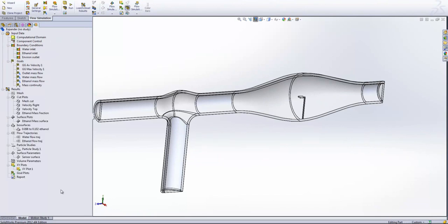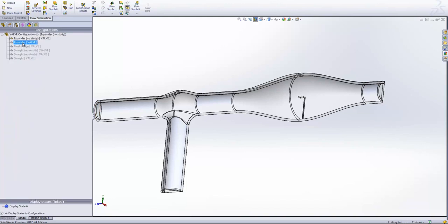The really nice thing that you'll see is we've also got all of our results analysis tools set up exactly as they were before as well. So we can now start to draw direct comparisons between the same plot on different configurations, which means we don't have to go fiddle the legend values or anything like that. We can directly compare similar designs. So let's have a look at how this design change has improved the situation.